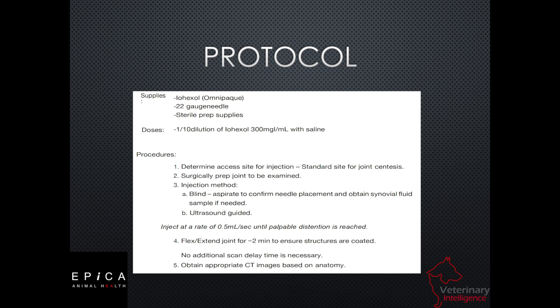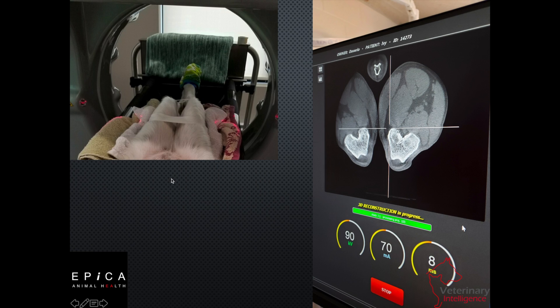After we finish the injection, we're going to flex and extend that joint for up to two minutes. Normally about 30 seconds of this is satisfactory, but if you want to go a little longer, that's fine. We don't have to wait at that point — we go ahead and do our scan and obtain the images that we want to see.